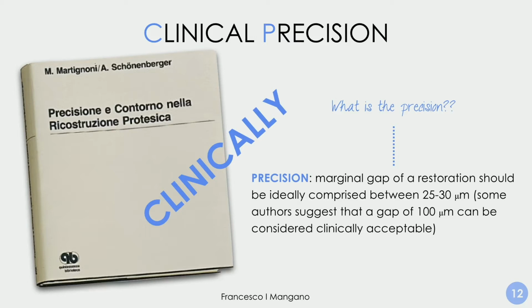And if you look at this definition, it depends not only on the scan, but also on the way you fabricate your restoration. You mill or you print your restoration. So this definition does not apply to the intraoral scanner.